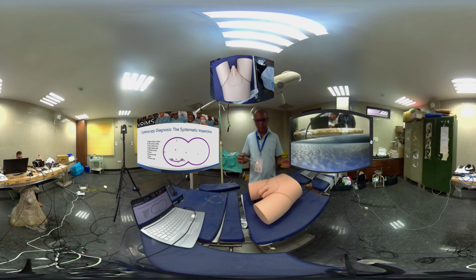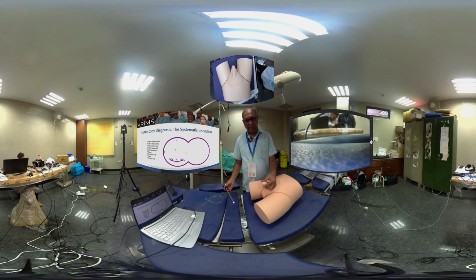And the way to do it is that, especially in men, you need to hold the penis like this between the 4 fingers, and you can use the thumb and the index finger to spread the urethral meatus. And then you have to remember that from the bladder there is a curve. So, bladder is here, urethra comes and then curves up. So, you do not want to pass through two curves. So, you need to hold the penis like this, so it is straight.